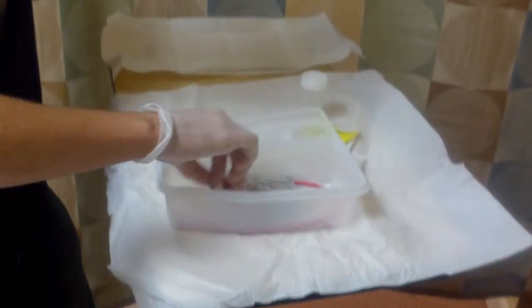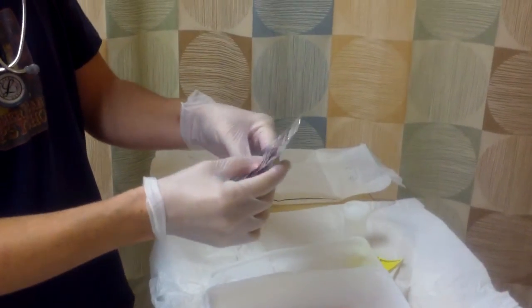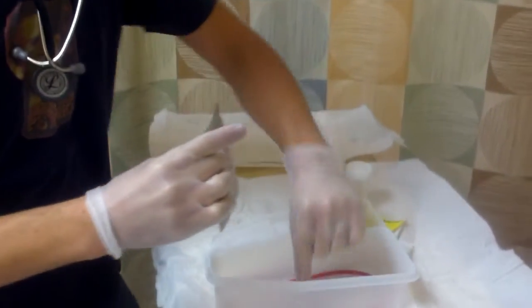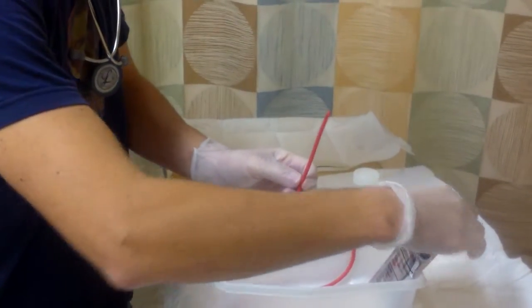So I'm going to prep my iodine sticks. I already noted for allergies that he has no allergies. So I'd tear this completely open. I would elevate my sticks so they're sticking out, so they're easier for me to grab. I'm going to stick this in the tray. So stick up there like that.